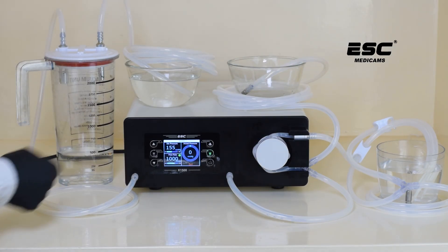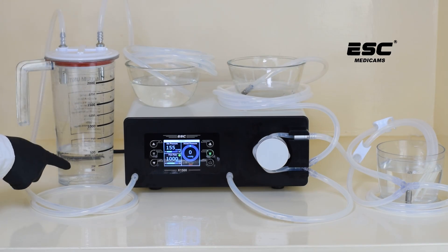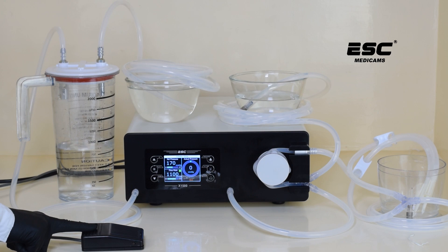Now let's begin. Press the suction button and you will see water from the bowl being sucked into the jar. The foot switch can also be used easily for suction.